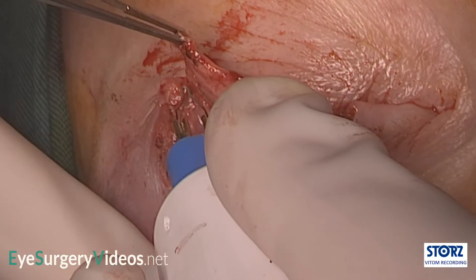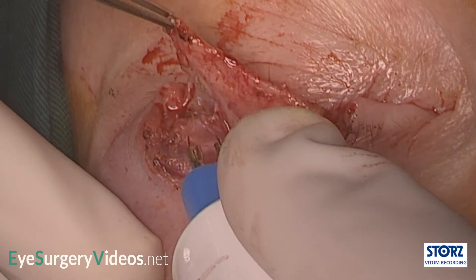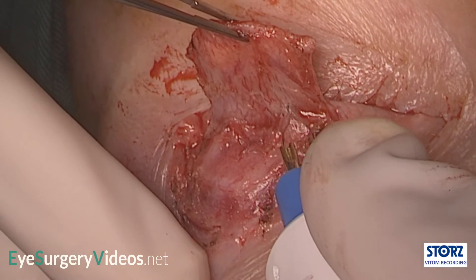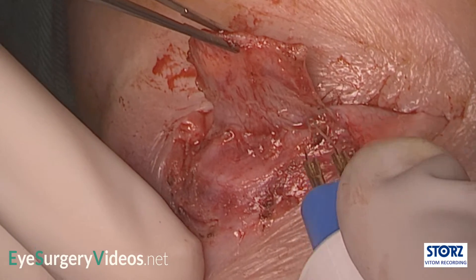The flap is further released until it can be advanced into the defect without tension. As with a lower lid tarsoconjunctival flap, this dissection can be between Muller's and Levator, or between Muller's and conjunctiva, which may be preferable as the attachment to conjunctiva alone probably increases its mobility and reduces tension that may result in lid retraction.